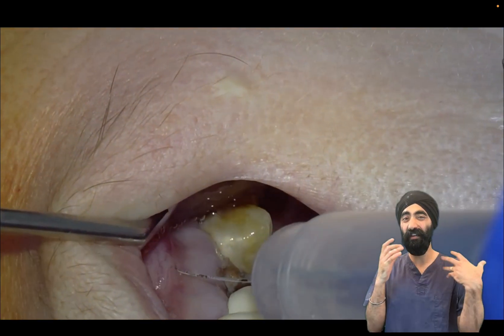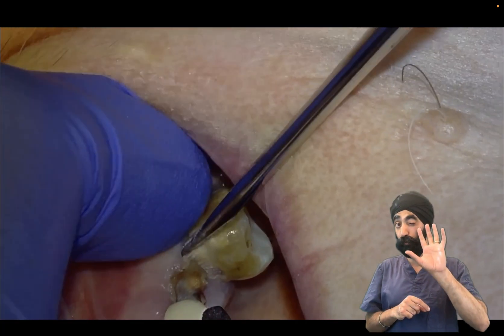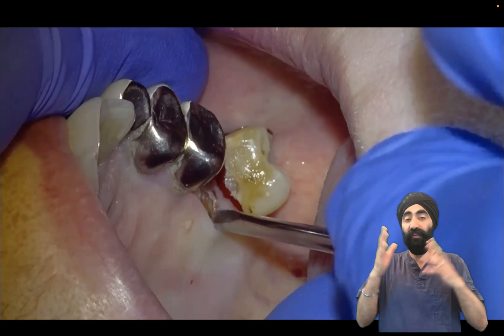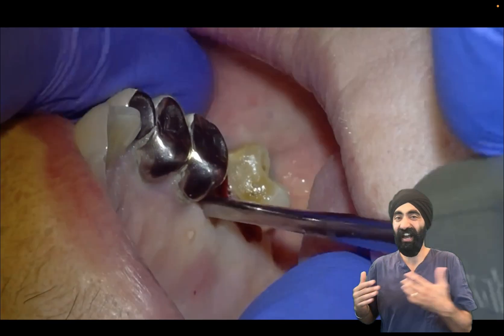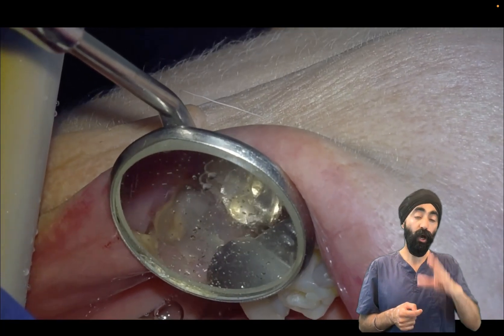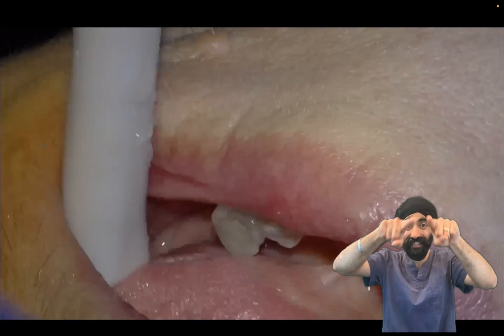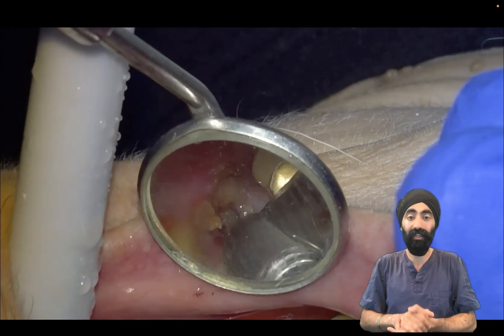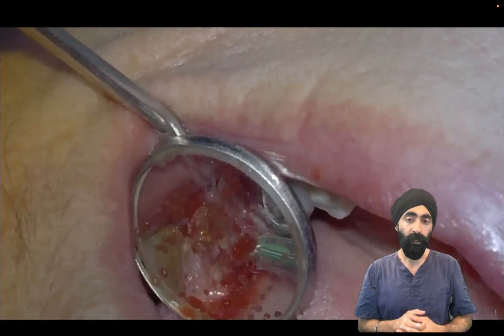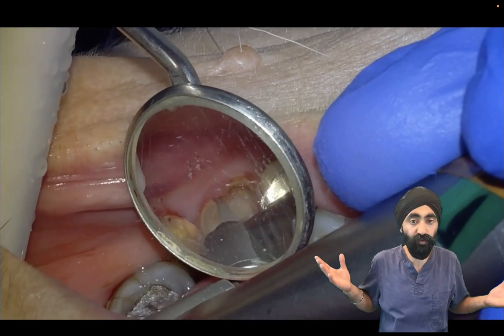I'm just topping up some anesthetic because there was an infected area there. I'm now going to be very carefully using a luxator — I don't want to put too much pressure on that very dodgy second premolar. I'm reflecting away some of the tissues palatally; it's a good thing to do if you ever suspect you could have a tuberosity fracture. I didn't worry about that here, but it's just a habit I got into. I'm using my electric handpiece with a diamond bur to section the mesial buccal and disto buccal, and it's not air driven and no flap, so there's no risk of surgical emphysema.